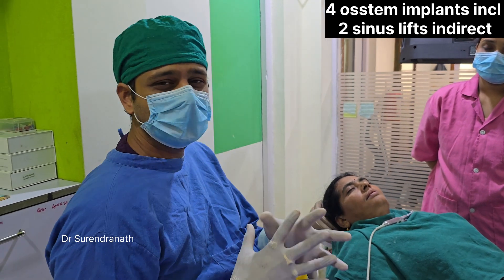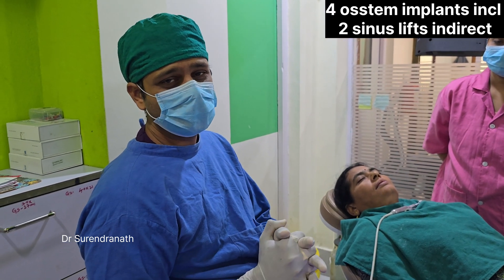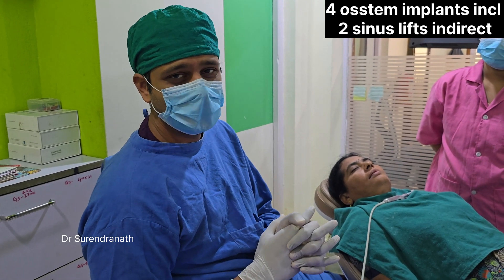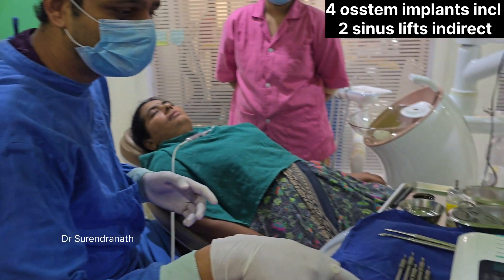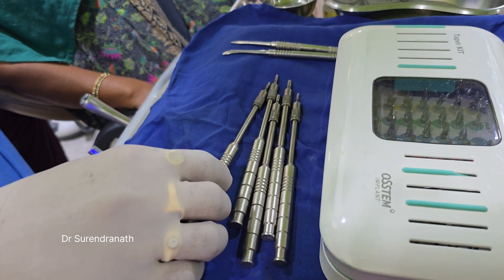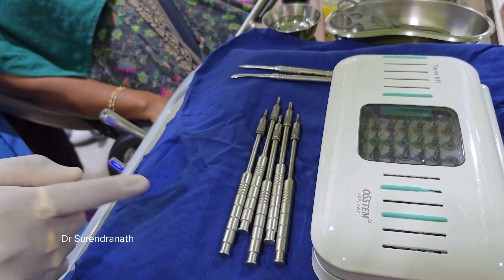Hello everyone, today we are going to do 4 conventional implants in a 47-year-old female. So these are the osteotomes — you can see these are for the sinus lifts. For the upper 2 implants we are going to do sinus lifts with these osteotomes.